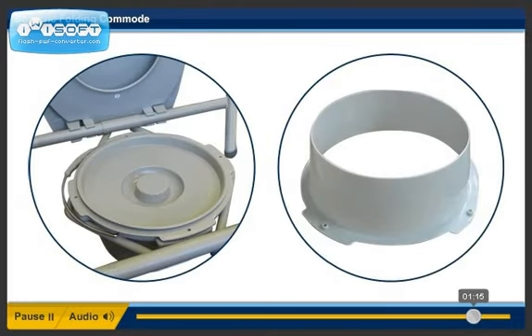Step 9. Raise the cover and seat to place the bucket or the splash guard into the bucket bracket. The splash guard is in use when the commode is being used over the toilet.